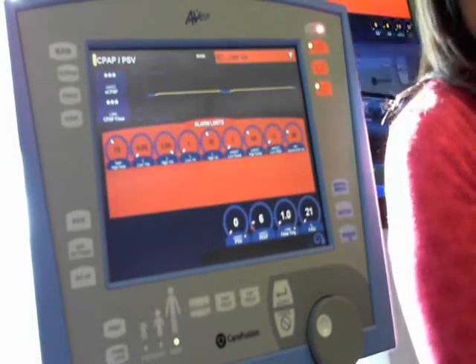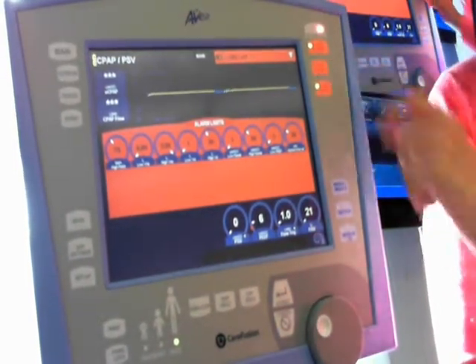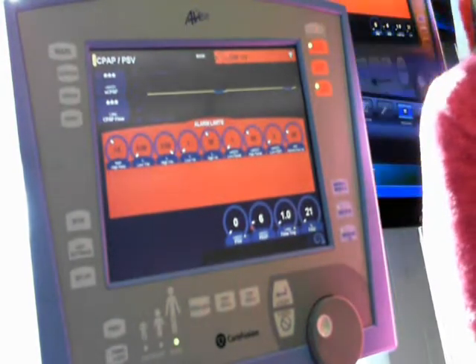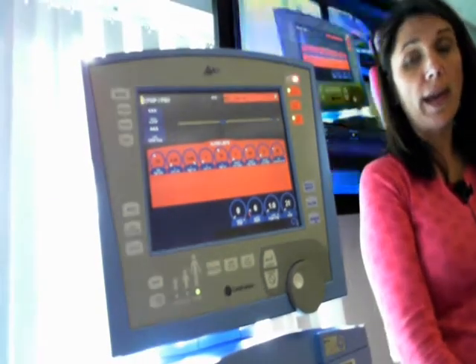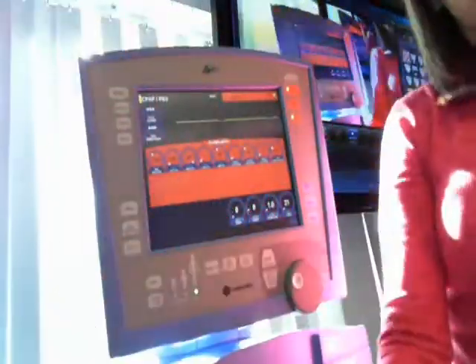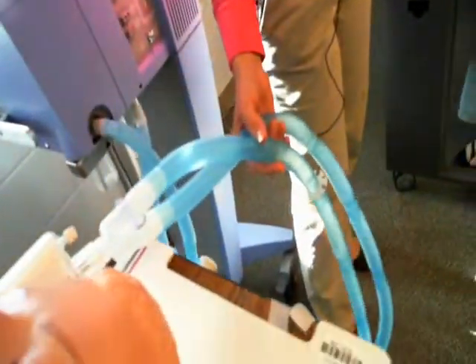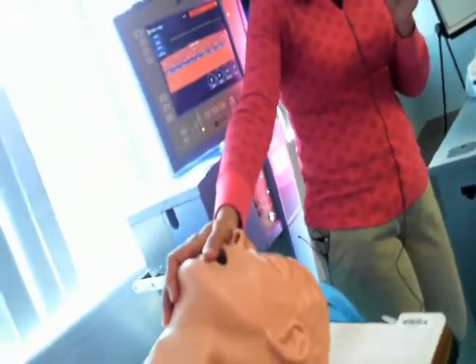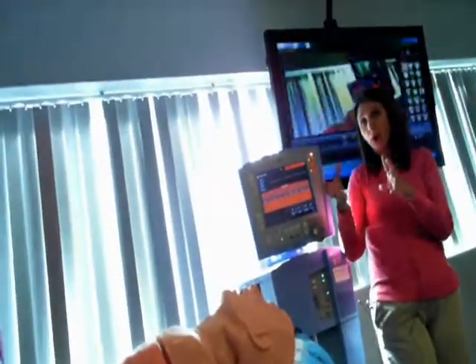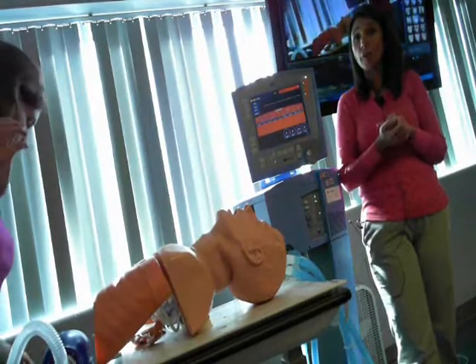Okay, yes. What causes, once you've got your patient intubated, that loud, real hoarse kind of sound when they try and cough? Okay, her question was, when the patient is intubated, what causes their cough to be more coarse and loud? Generally, the reason, if you're hearing it and they're on a vent, is because it's very magnified coming through this tube into these corrugated tubes. Okay, so those act like a sound magnifier, I ought to say, and it makes it very loud. The other issue is you are introducing positive pressure into the lung, so that creates greater lung recoil. So that cough has more pressure behind it.